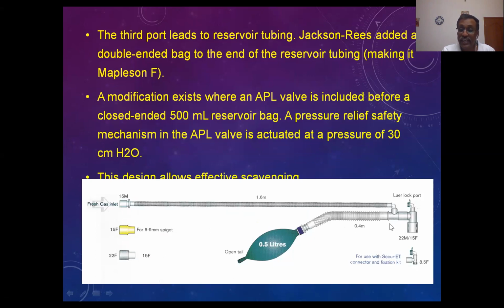First is air dilution, and a hypoanesthetic mixture is delivered. The patient gets a hypoanesthetic mixture, going for light anesthesia, and we are not able to deepen the anesthesia even though more and more anesthetic is given to the patient.